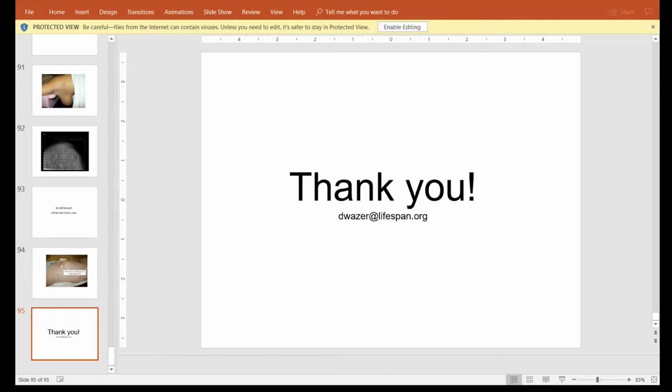But occasionally, with a very large breast at a difficult location, if you can't compress to 8 centimeters, then I would suggest that the other techniques should be used. As to applicator size, Ray, just refresh my memory, we have an 8 centimeter applicator, is that correct? Yes, for round applicators, we have 4 through 8 centimeter diameter. Right. So really, the target volume is limited by the applicator size, but there's a broad array of applicator sizes and shapes.